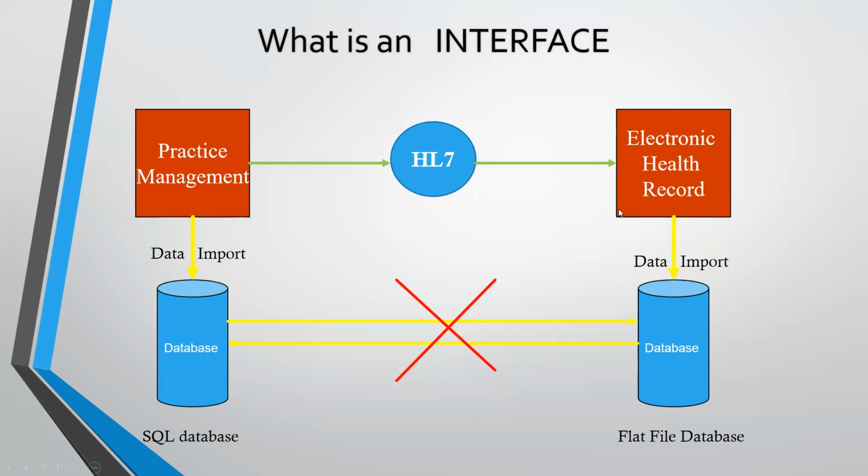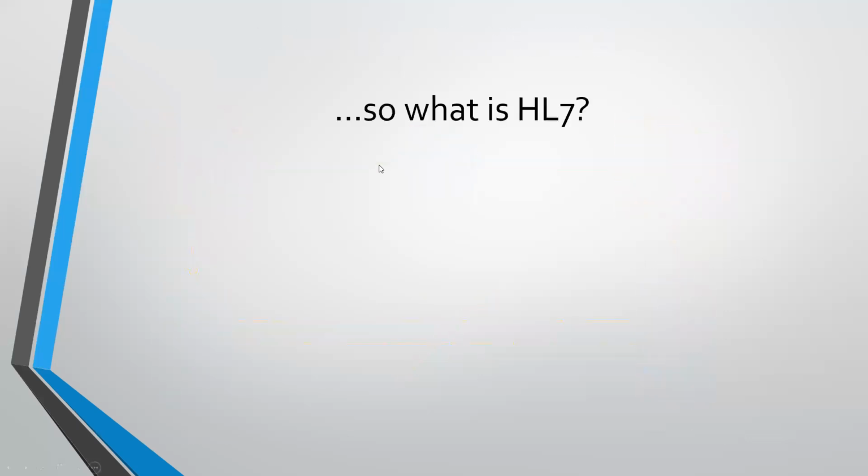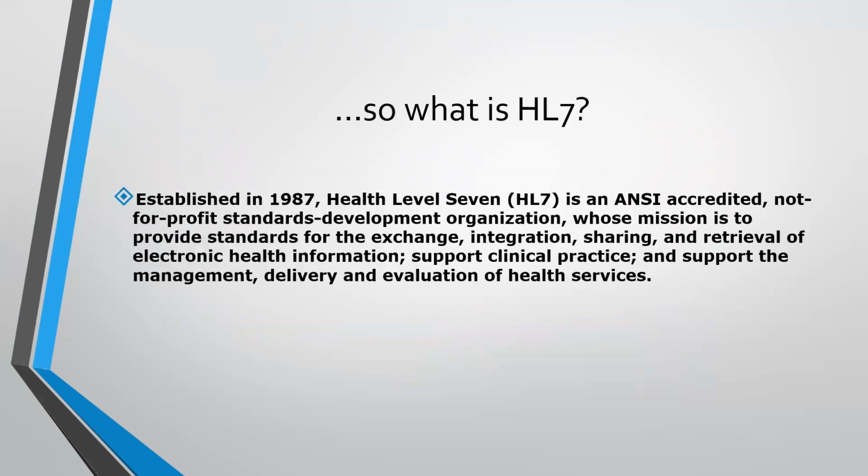Okay, so what is HL7 in basic terms? It is nothing but a messaging standard. Many think that it is a language, and many call it a language as well, but apparently it's not a language. We just coined the term language so that it would be easy to call, but it is a messaging standard, a data standard that is used to tell that this is the standard structure that you have to follow if you want to transact data from one system to another.